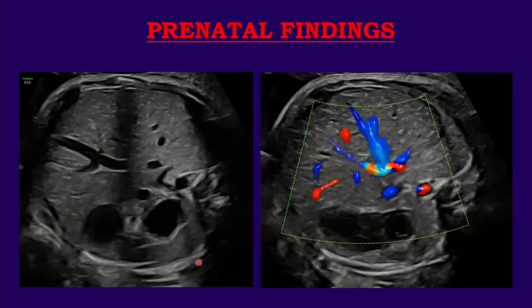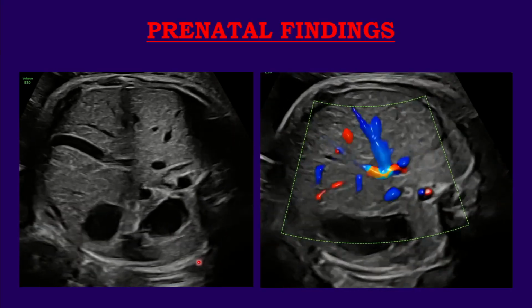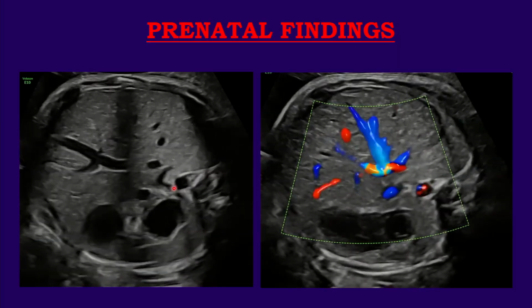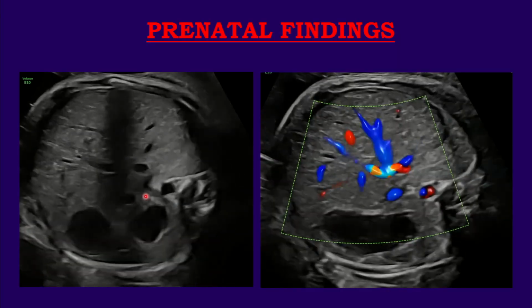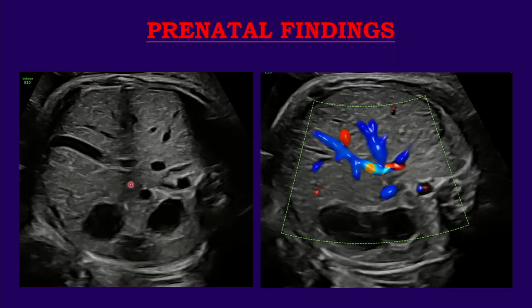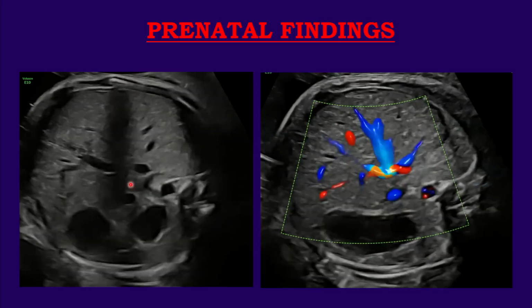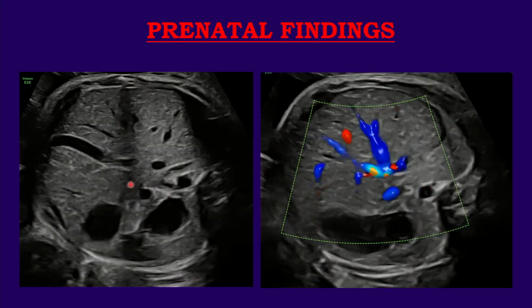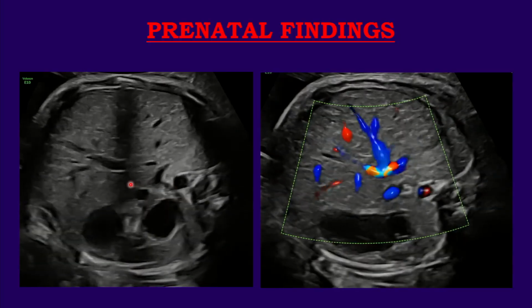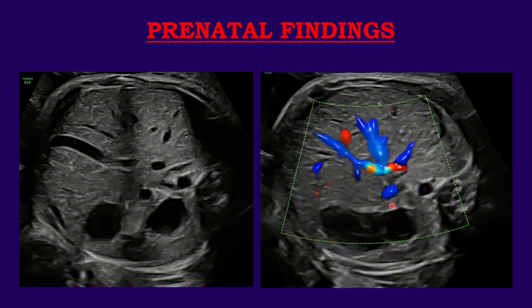But I want to attract your attention back to the abdomen, and this is where your fetal echocardiogram and the fetal cardiac assessment is supposed to start. If you look at the position of the aorta, this is the inferior vena cava, and this is the other structure. This structure should not be there. So that's why we look at the anatomical landmarks at the abdominal circumference. We need to confirm not only the things that should be there, but also note what looks unusual, what additional structures. So then we apply color, and we can see it's vascular.